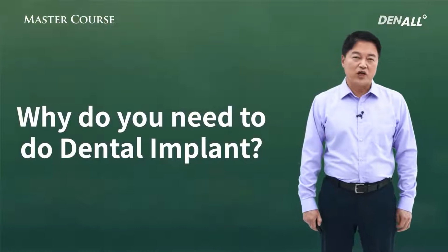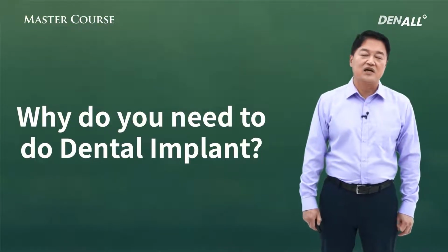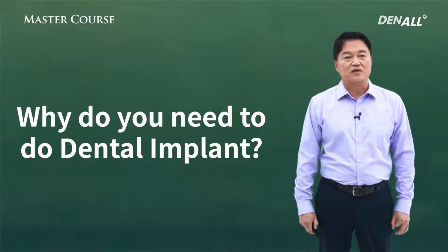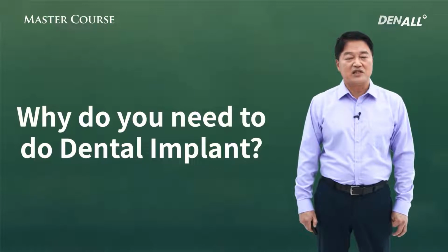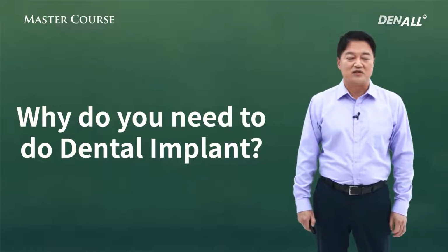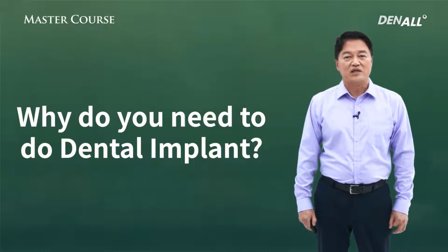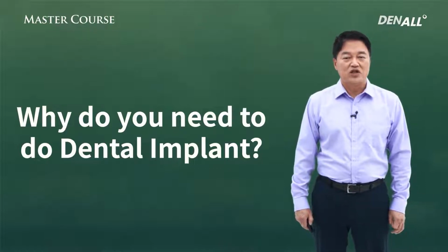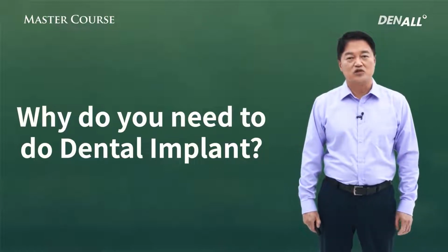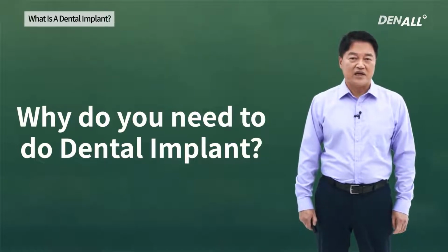Let's think. Why do you need implants? Before implants became more available, we provided bridges or dentures. However, as implants became more commercialized, they can cover a lot of the disadvantages of bridges and dentures, and they have their own advantages. In the missing area, implants can provide optimum function. That is why implants are necessary.